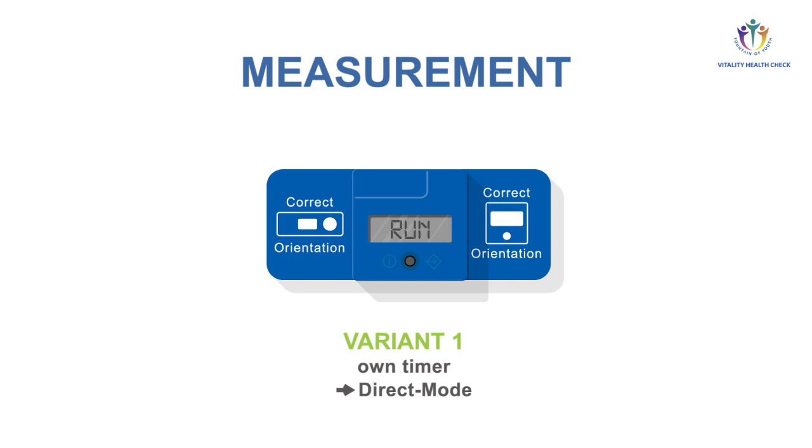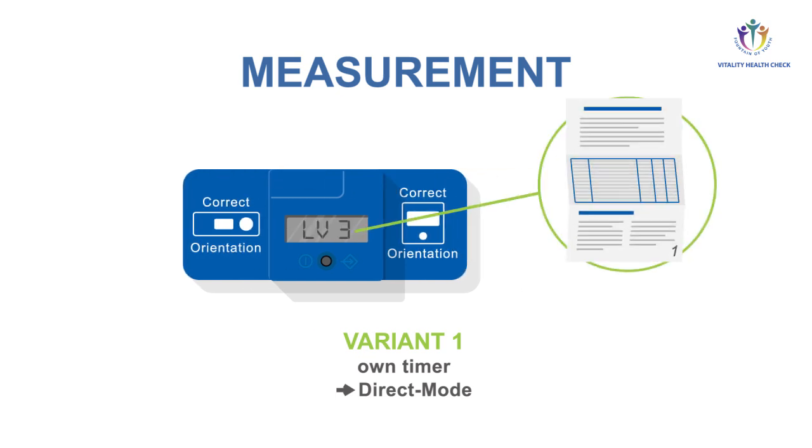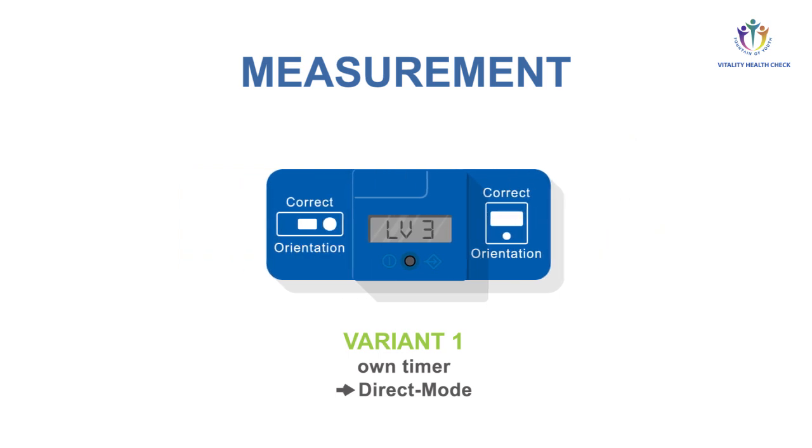In both variants, the quantification results appear on the display. A relative vitamin D level, level 1 to 6 is displayed. See evaluation table on page 1 of the instructions for use. Quantitative results are shown in nanogram per milliliter and in nanomole per liter.